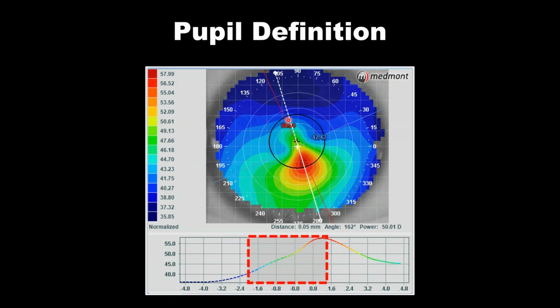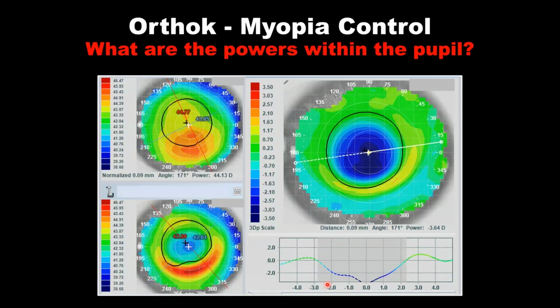So that's an 18 diopter distribution of power. That's a severe amount of power that's distributed within the pupil. So this simple little thing to understand the kind of vision this patient may have is very valuable to us in any pre-fitting contact lens consideration.